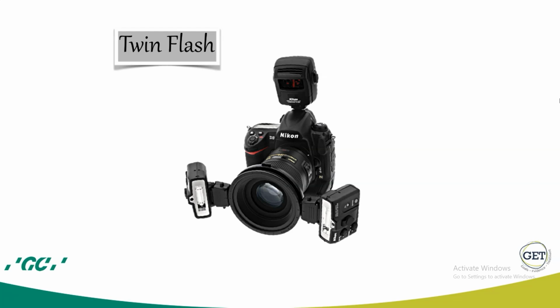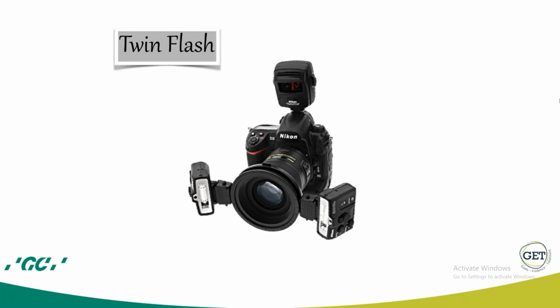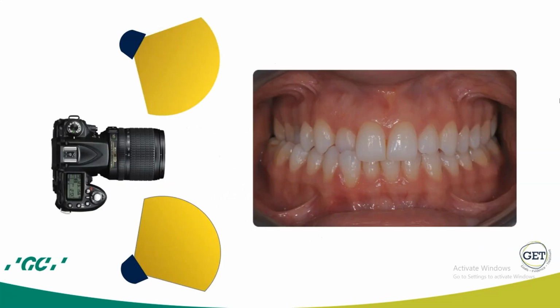The best light source for intraoral photography is the twin flash. Twin flash allows you to use the light in different angles so that you can create a more detailed photograph. Okay, paraflashes. These flashes are the best equipment to take good extraoral pictures. On-camera flashes that we talked about are all for intraoral photography. They cannot give enough amount of light for extraoral photographs.